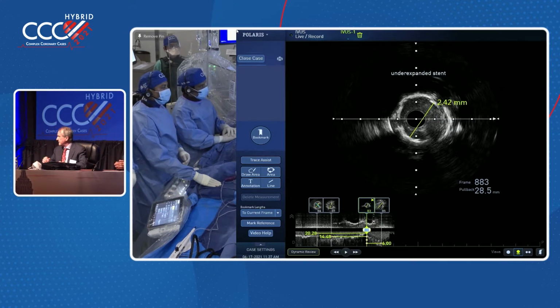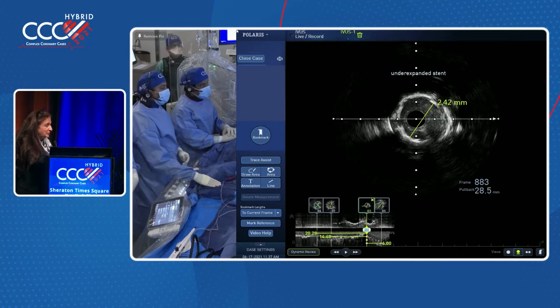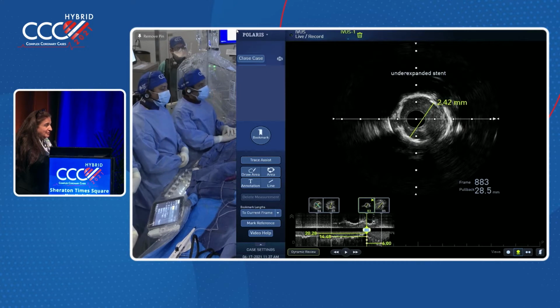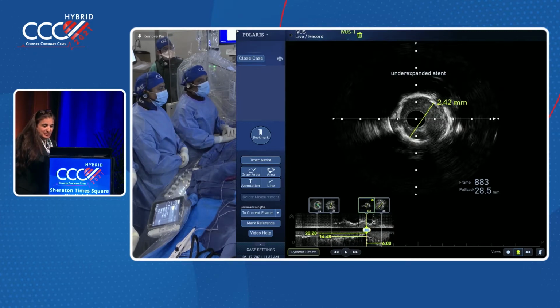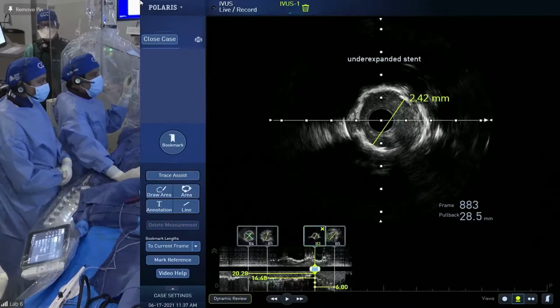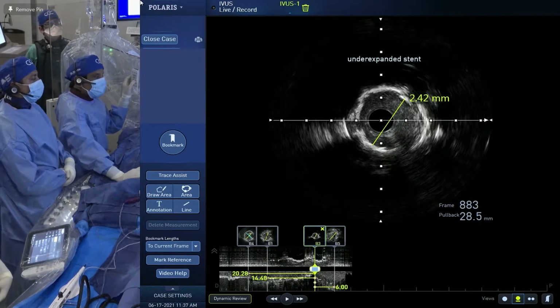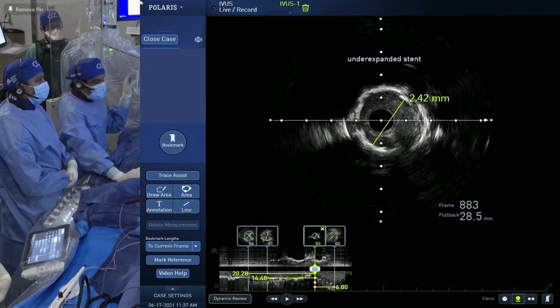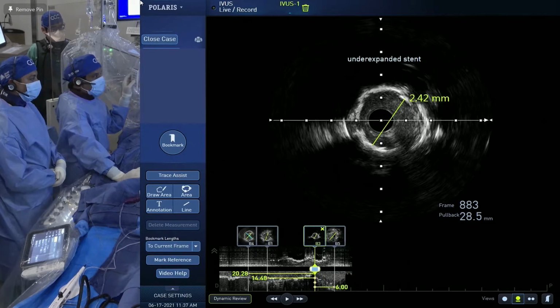So we have a 50-50 vote, I think, for laser and rotational atherectomy. I don't really like that high pressure balloon. I get nervous, but I've seen you do it, Dr. Colombo. But remember that high pressure balloon, Roxana, that OPN NC, is a double layer balloon, not available in America yet. It's used for that purpose in many places outside.